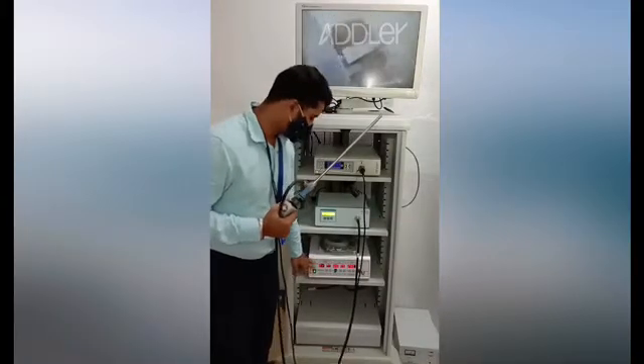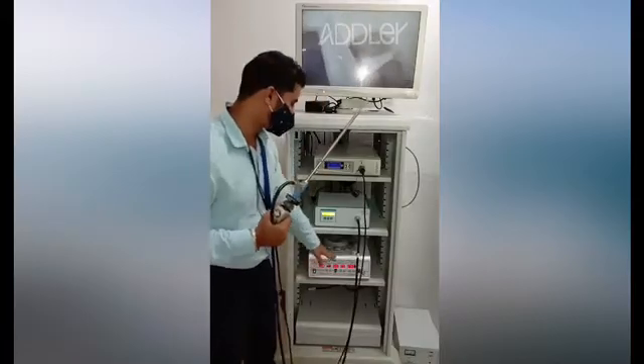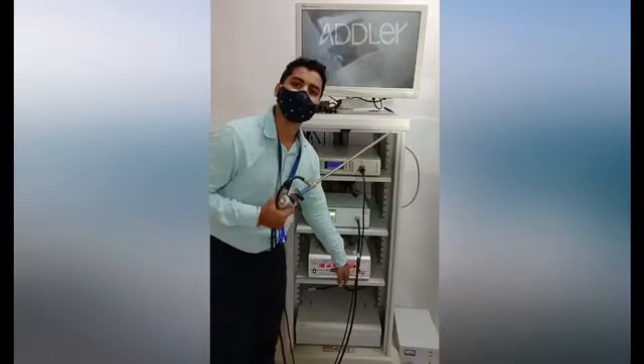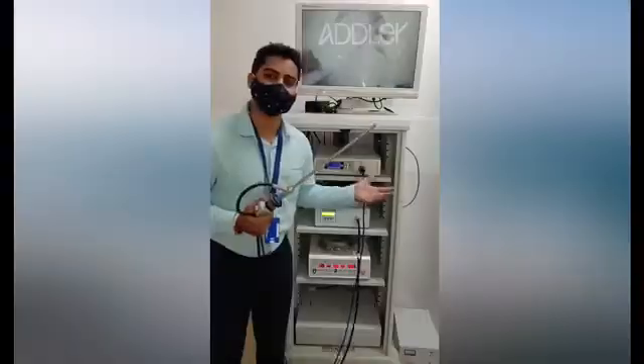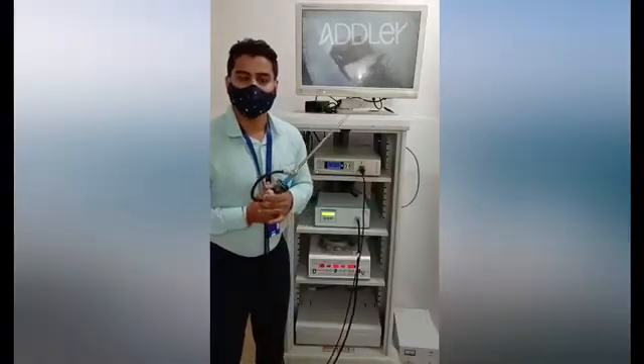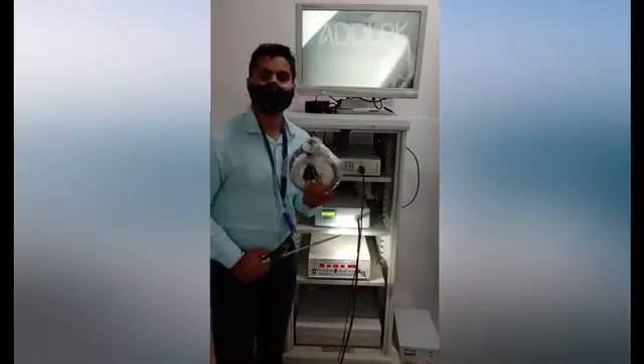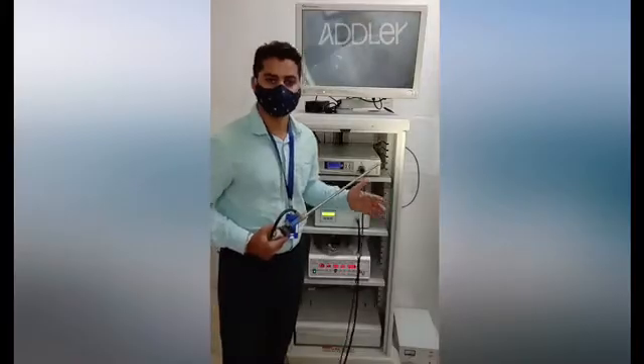This is the Adler high-flow CO2 insufflator, with 30-litre capacity. It comes with Veress needle mode and trocar mode. It also has a very unique feature called air mode — in case of emergency, if the CO2 runs out, air can be used for insufflation with the help of this mode. These are the tubing accessories that come with the Adler insufflator, along with 1-year warranty and service assurance.